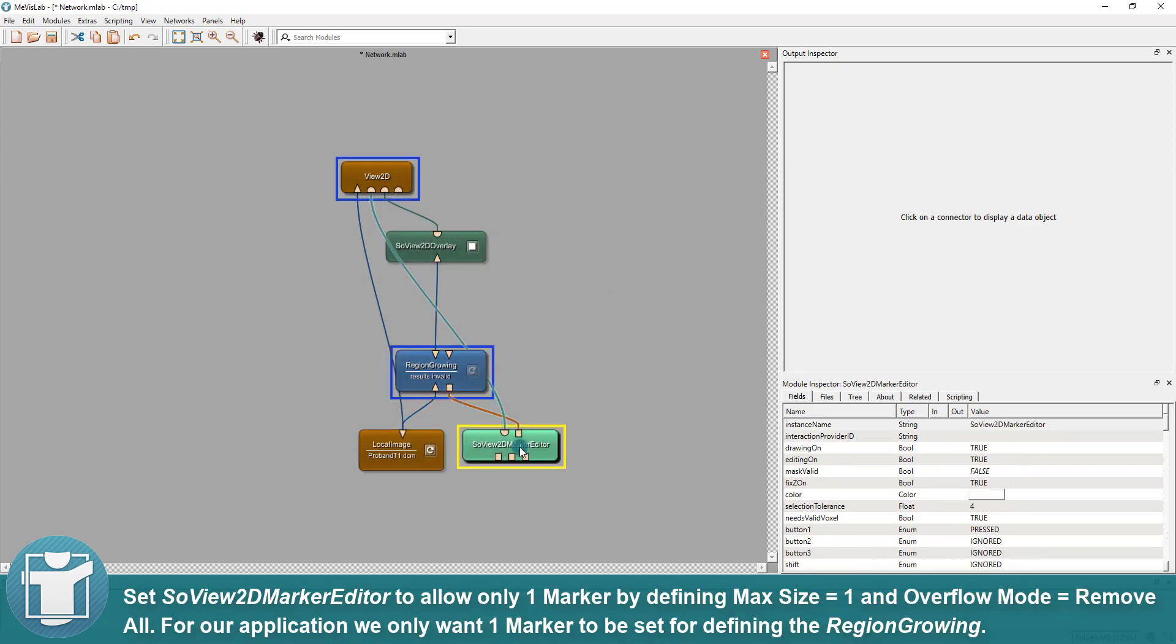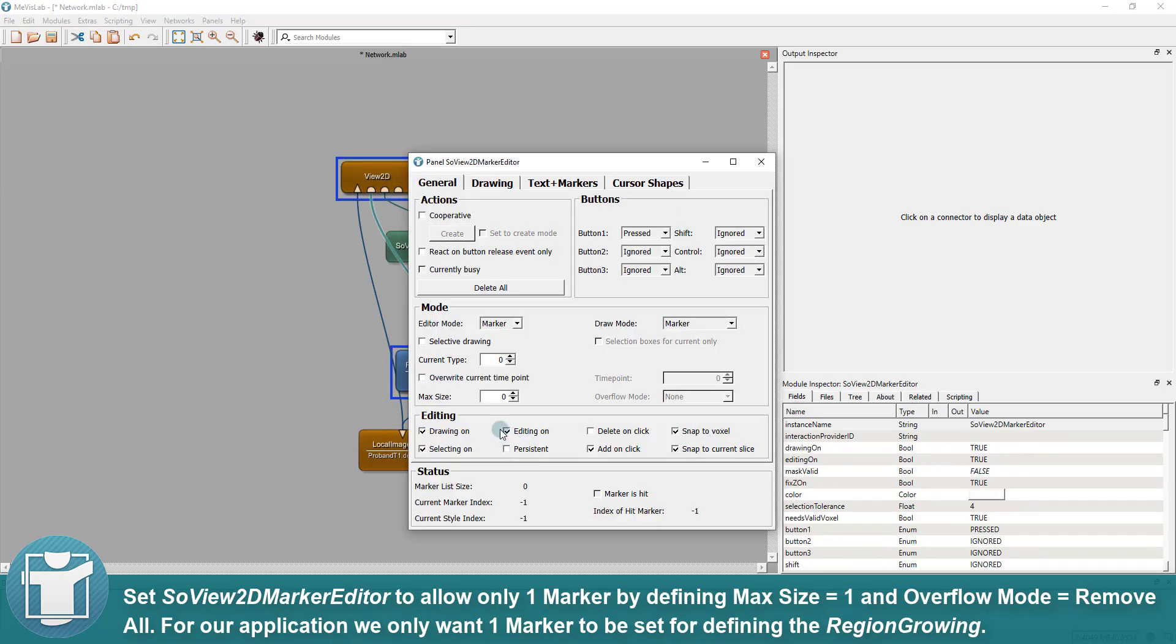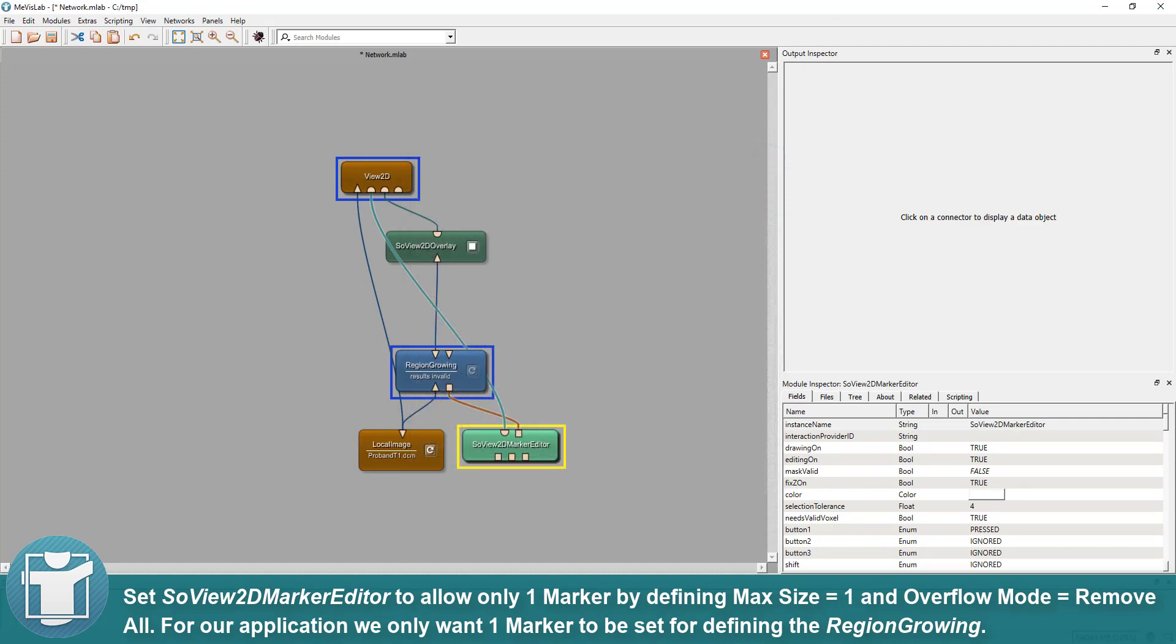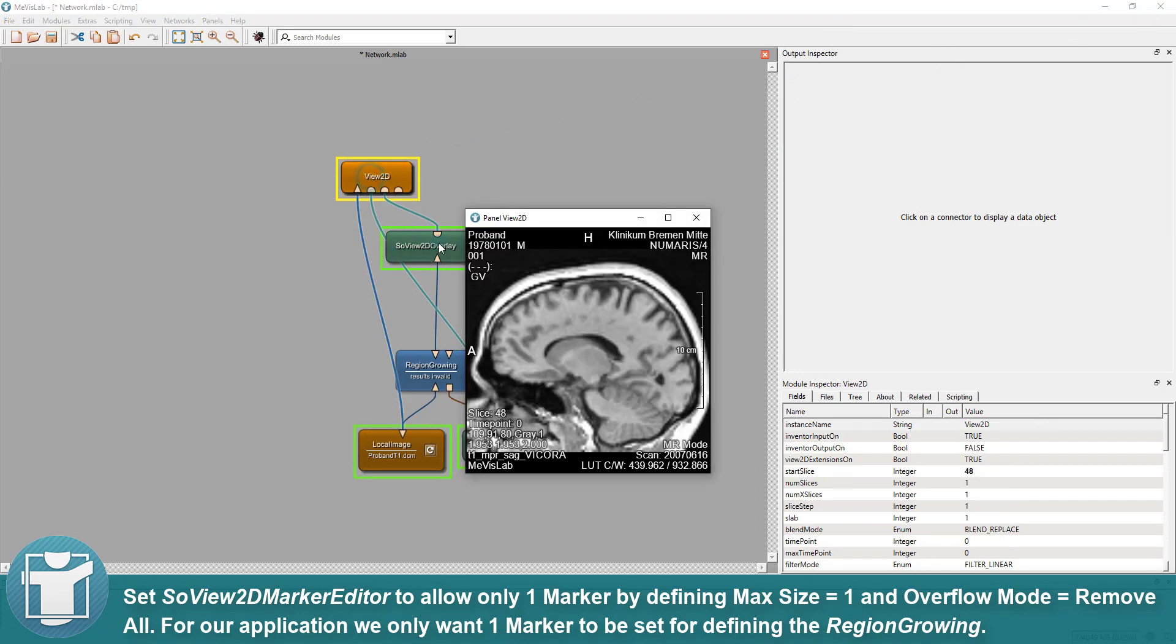Set SoView2D marker editor to allow only one marker by defining max size as 1 and overflow mode as remove all. For our application we only want one marker to be set for defining the region-growing.